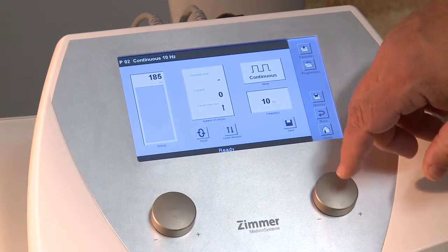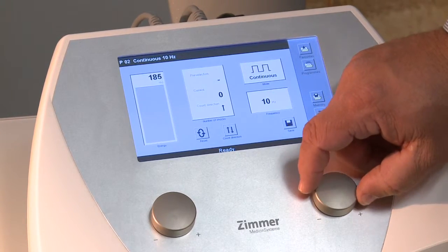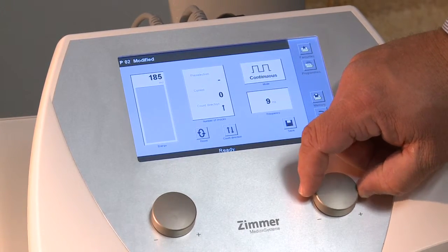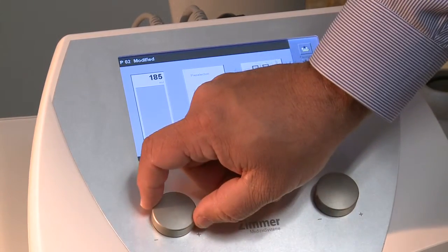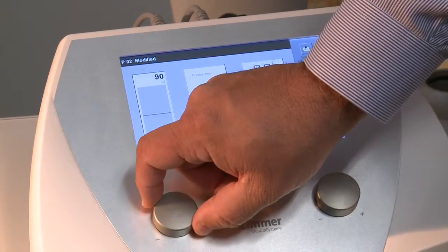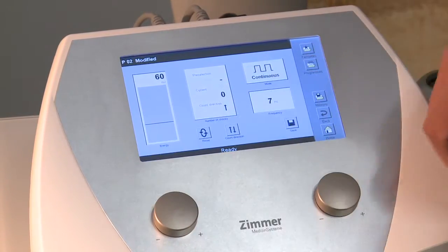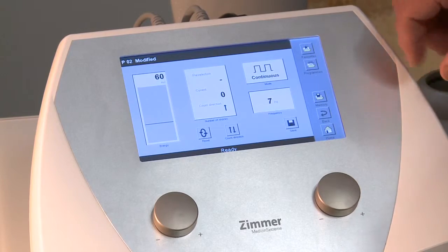If you choose to make a change, it's simply a turn of the knob. If you want to change the millijoules, simply turn the millijoules knob.